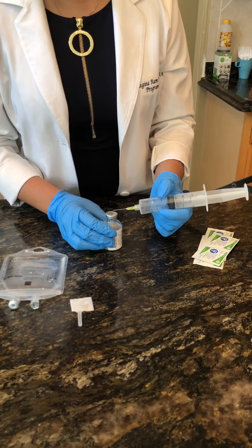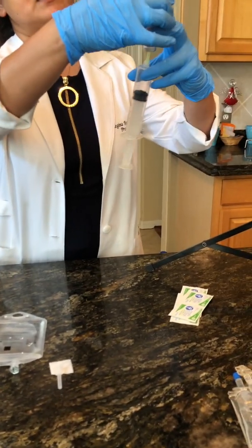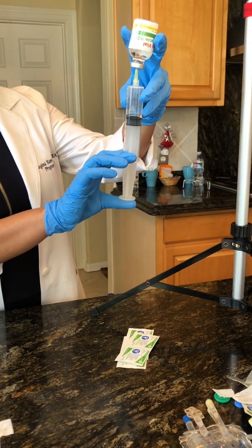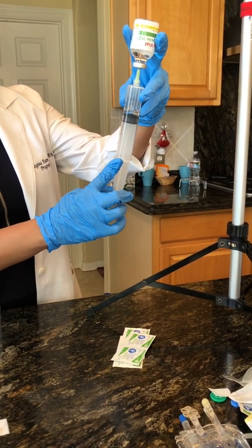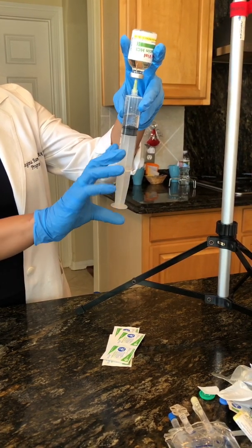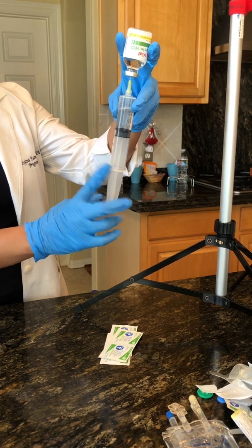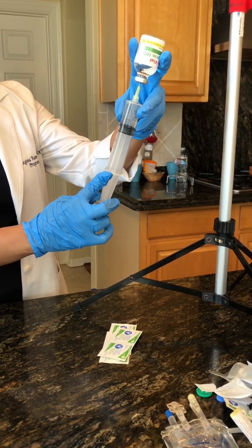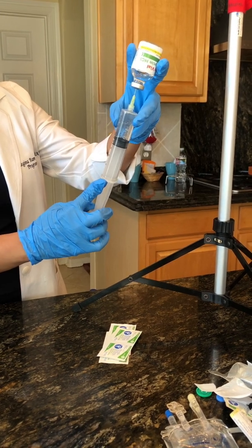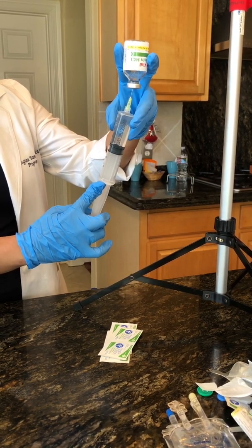I'm going to go back in, slight lateral pressure, push down a little bit, and flip. Remember, this vial is a little bigger than what we're used to, and my syringe is also bigger. Just take your time and go ahead and milk. In this case I need the full gram of vancomycin, so it doesn't matter if it's at 20 mLs or 21 mLs. The goal is to empty out this vial because I need all of this powder. I'm emptying out the vial.